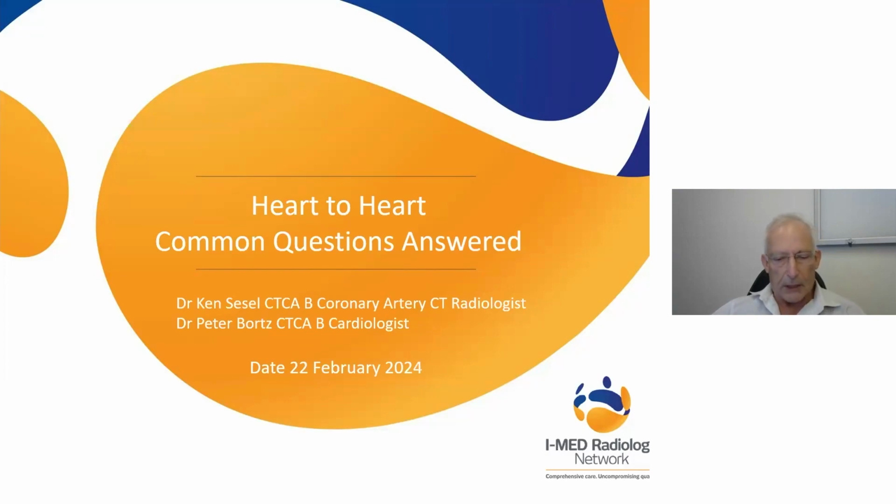So this patient, please try and remember this history. He's a 56-year-old gentleman, presented a week ago with hyperlipidemia and a mildly positive stress test, and he was sent in by a cardiologist for a coronary artery CT scan. As part of the coronary artery CT scan, in our centers, we do a calcium score as a routine, which is included within the CT coronary angiogram study. Now, this patient's calcium score was 9.14.